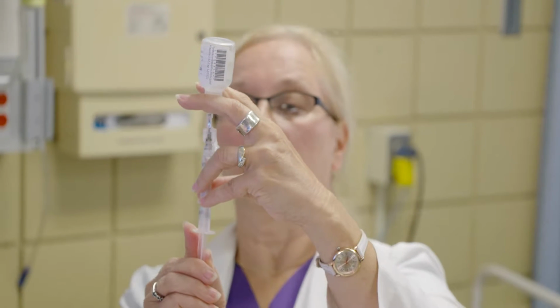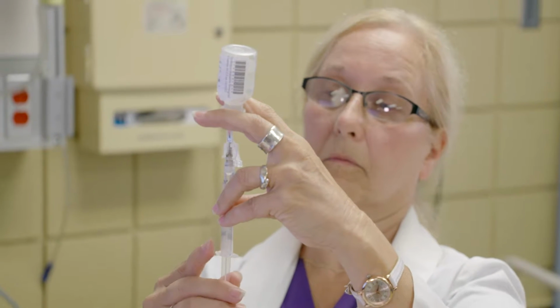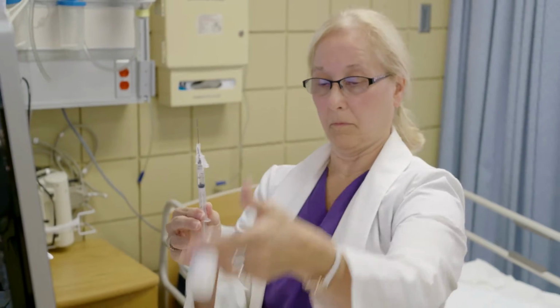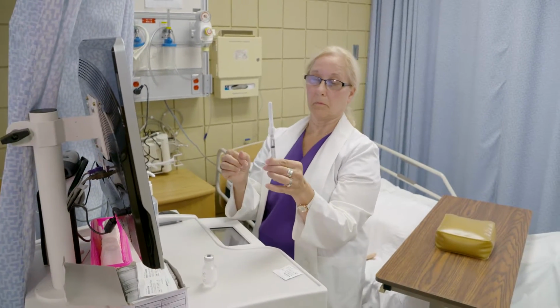Turn the vial upside down while holding the syringe so the syringe will not come out of the vial. Pull the plunger down for the medication to fill the syringe at 1 milliliter, and then remove the syringe from the vial and recap the needle carefully. This is the only time you can recap the needle while at the med cart.